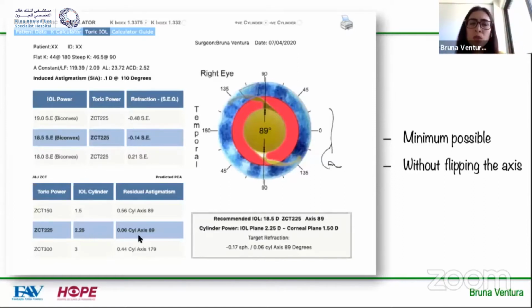It was something that was true for the last years. But when we're talking about premium IOLs and patients with more and more expectation of being glasses independent with wonderful vision, and patients that are so active right now, we see that the population of patients with cataract nowadays is totally different than 20 years ago or 10 years ago.